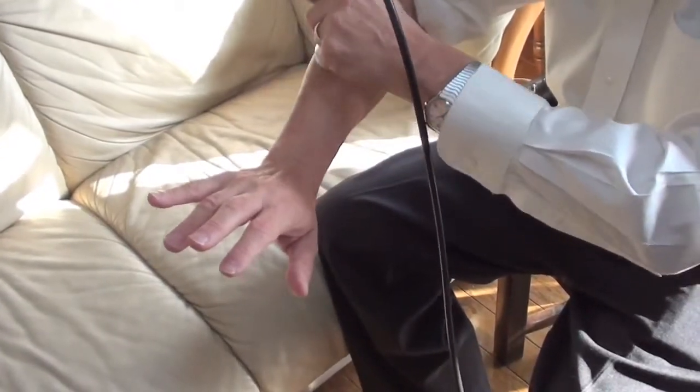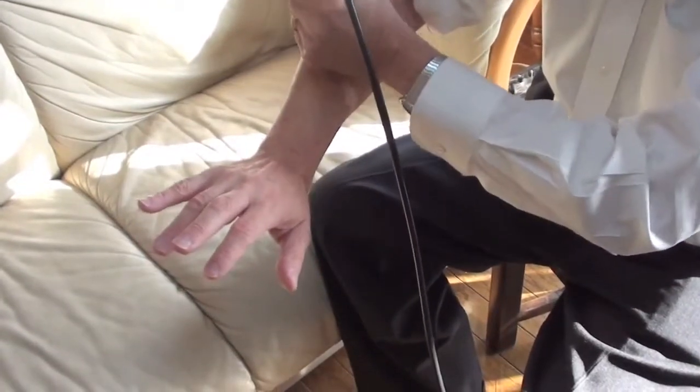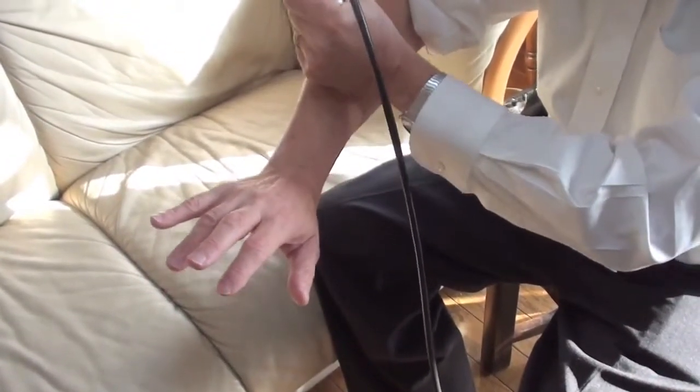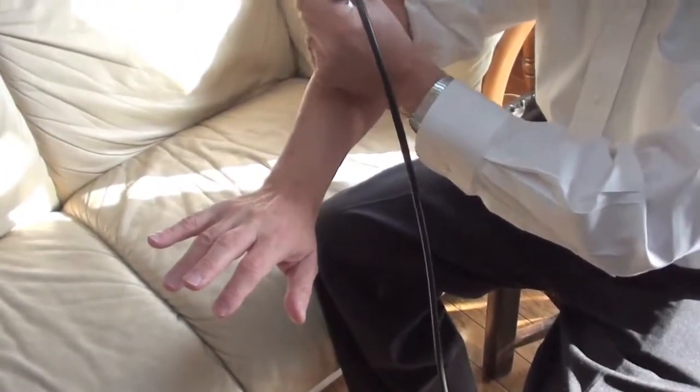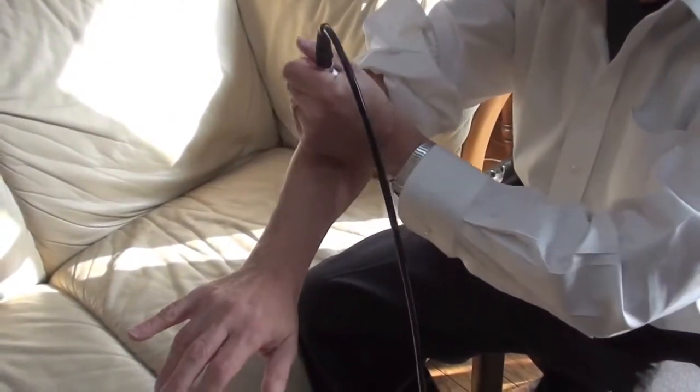Notice the speed — it's a painting motion. You may want to do a little bit of pressure; I'm actually pushing. Do not be concerned with the edge of this therapy handpiece because it will not cut or irritate the skin. It may leave a little dry mark, but it will not do that.